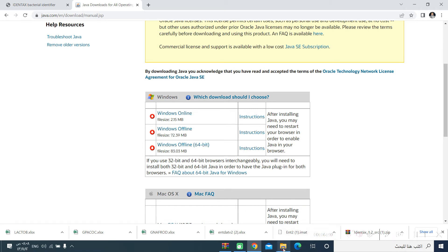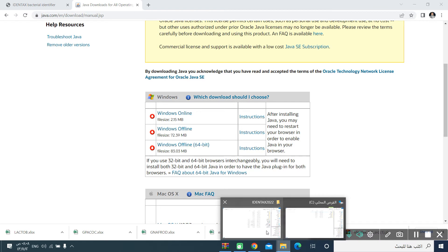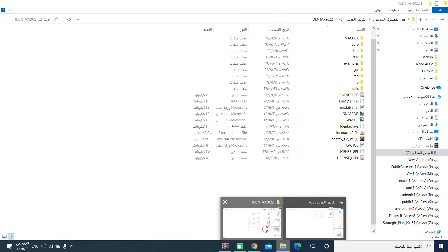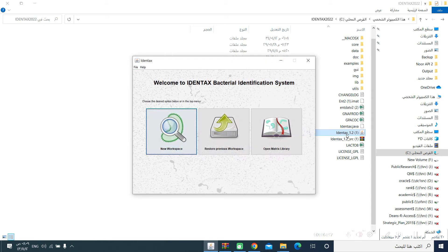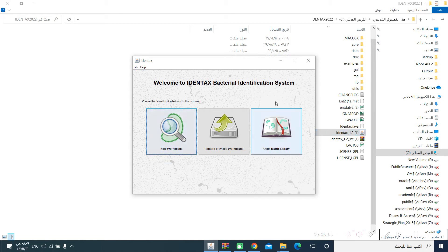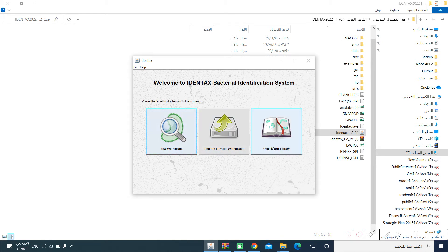Going back to the software, IDENTEX. You can just double click on this software. You will have this starting screen, which is composed of three main components: New workspace, restore previous workspace and open matrix library. We will try to start with this one.